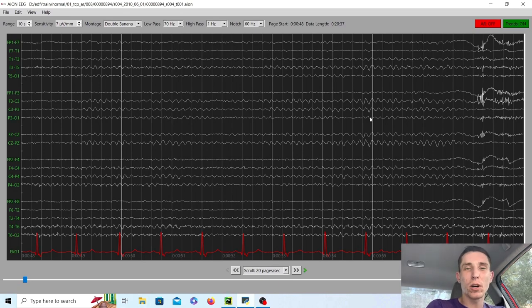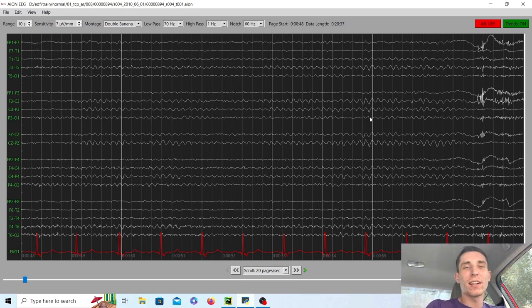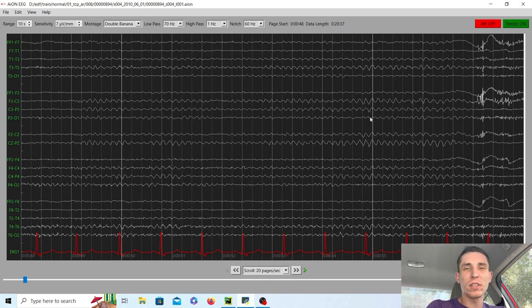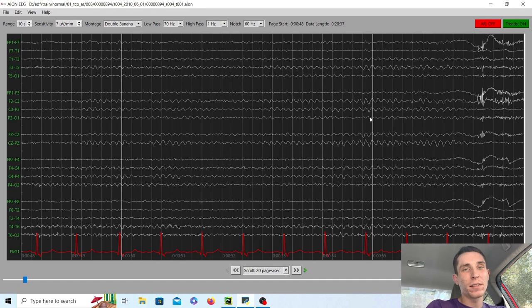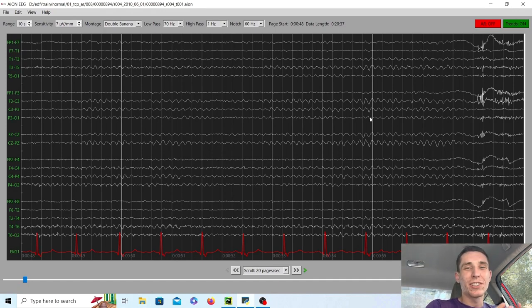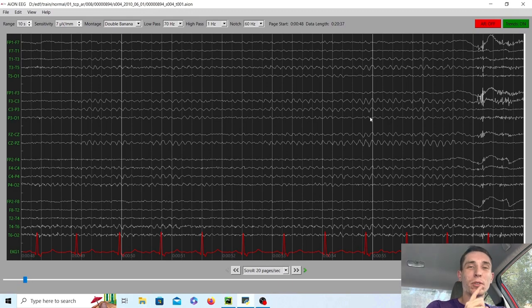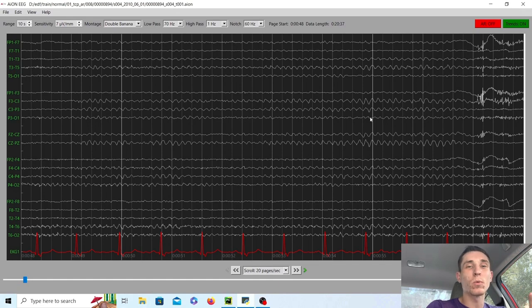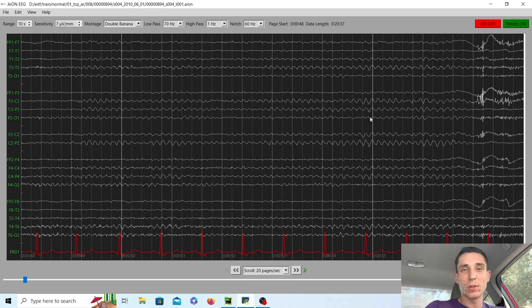She's currently on Depakote for her seizures and I guess she's getting essentially a checkup EEG. She's been having trouble sleeping lately but luckily in this EEG we have some good news. She was able to fall asleep and we're able to see not only vertex waves in stage one and two sleep, we're also able to see sleep spindles in stage two sleep.